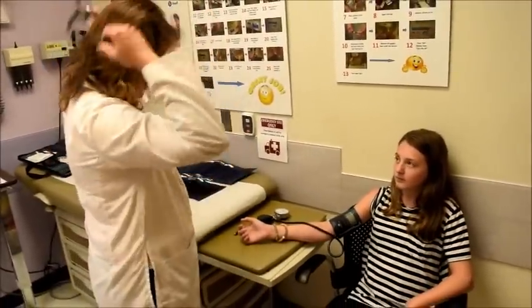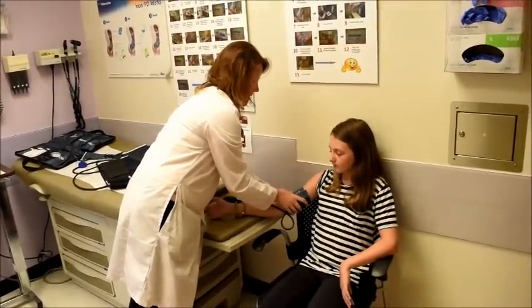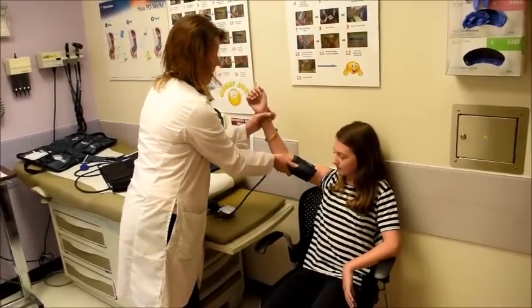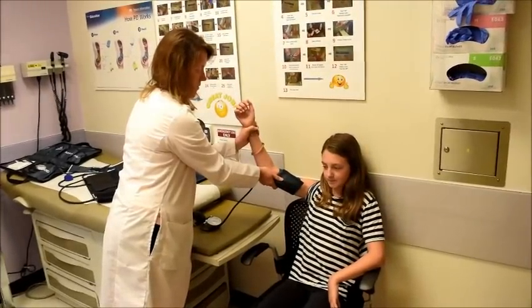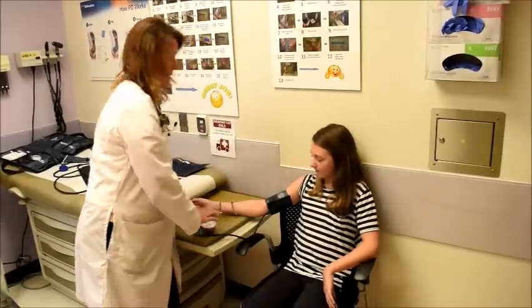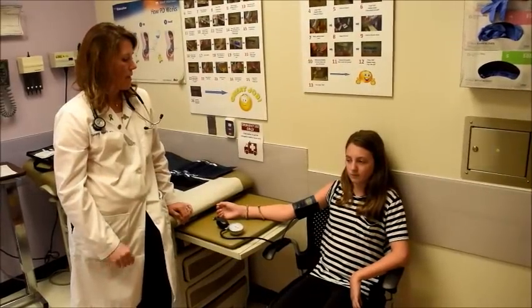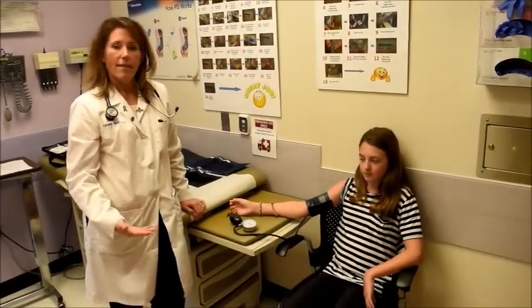So you're going to want to make sure that you record that number and that this cuff is completely deflated. And then you'll set your timer and make sure that you raise her arm passively for 15 seconds. And then after those 15 seconds are over, you'll allow her to rest her arm for another 15 seconds like this. And then you'll take two more blood pressure measurements in exactly the same way, making sure to record them after each measurement. And that's it.